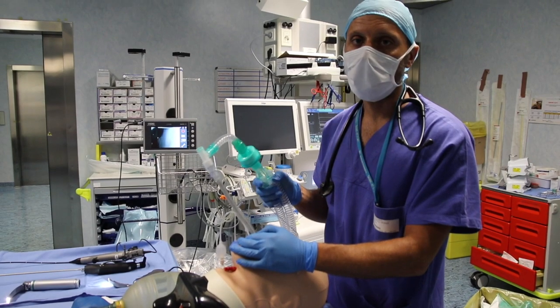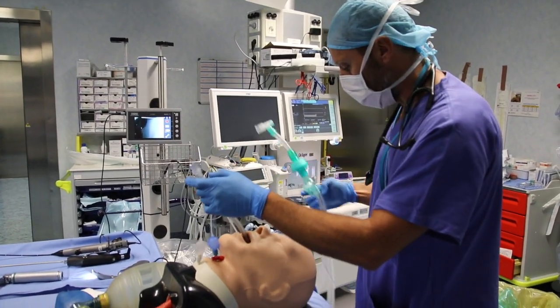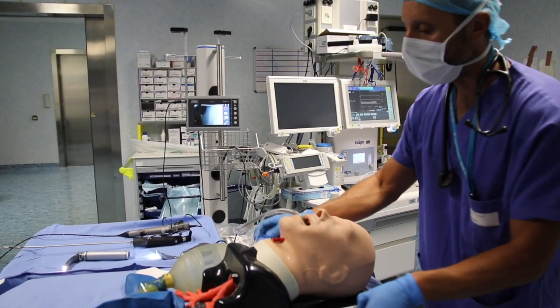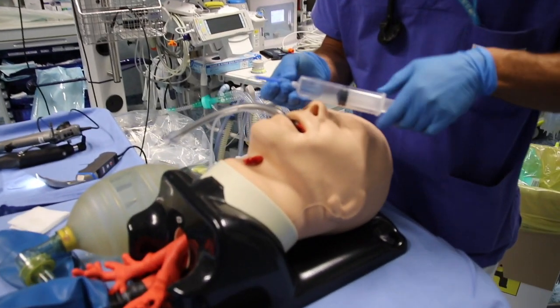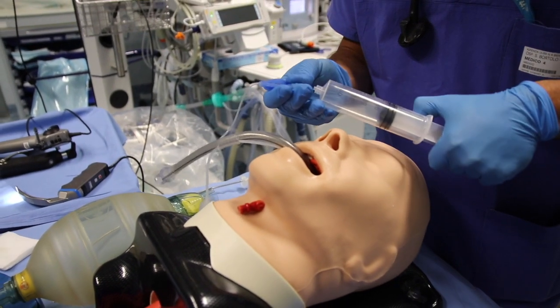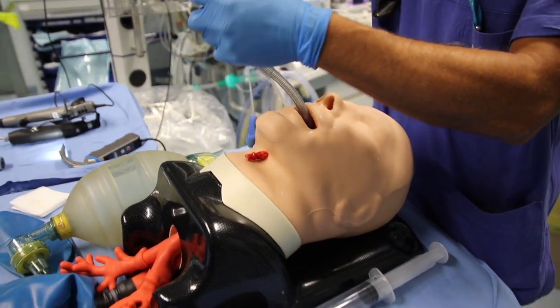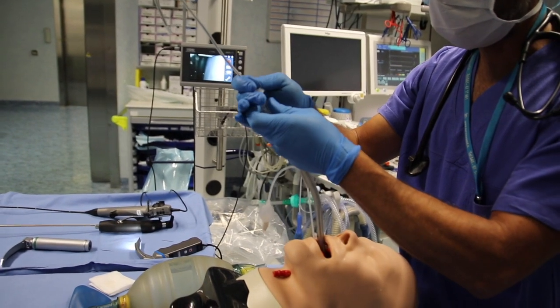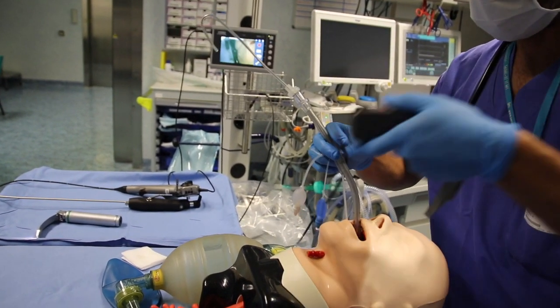If intubation is required, first disconnect the patient from the ventilation circuit. Deflate the proximal cuff so that the laryngoscope can be introduced into the patient's mouth. Insert the spritz tube's dedicated stylet inside the tube, then retract the tube slightly to allow easy insertion of the laryngoscope's blade.